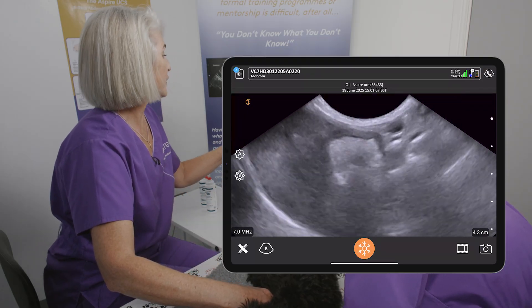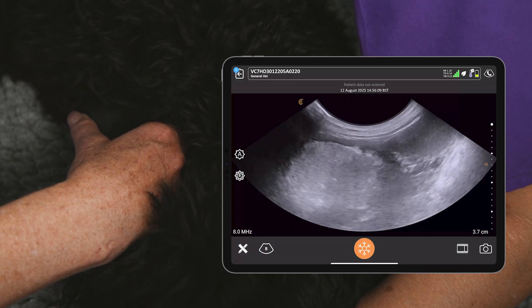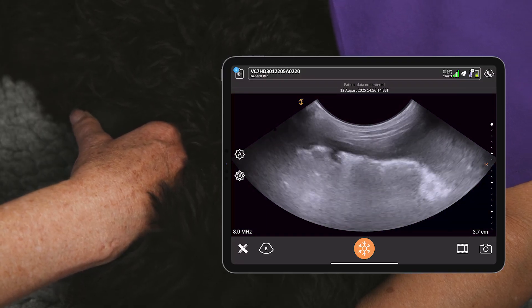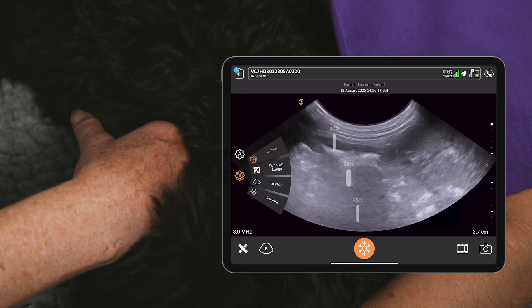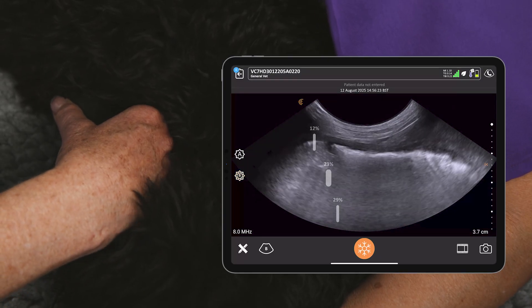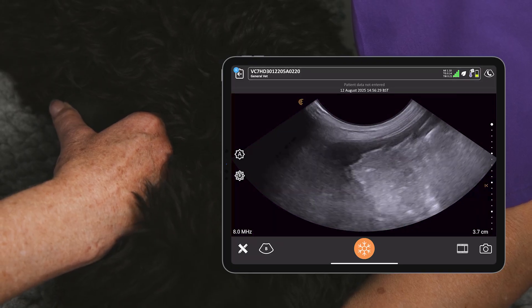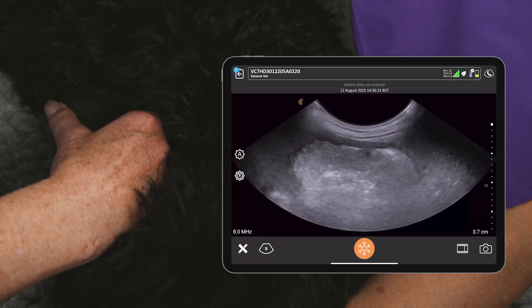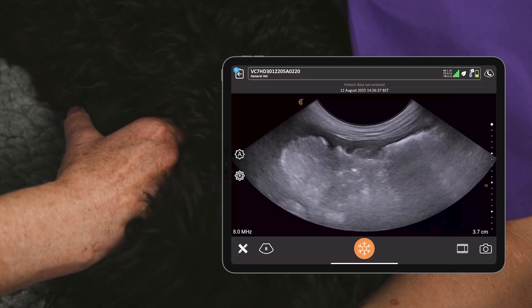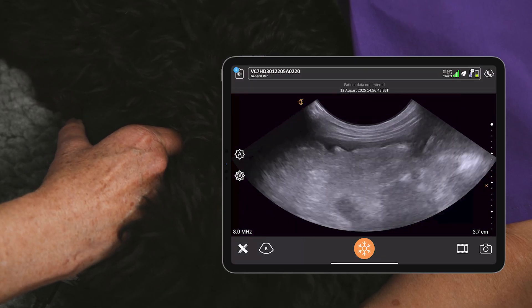Looking at the wall layers here, you can see it starts off hypoechoic, then hyperechoic, then hypoechoic again, and then you have this bright fine serosal margin around the outside — that's the normal pattern. If you have a loss of wall layering, that may indicate some sort of disease process. It's quite helpful to play with the dynamic range when looking at gastric wall layers, because we've got a black-white-black-white wall layer pattern. By going down on dynamic range you enhance contrast, so you should see that wall layer pattern a lot better than with a high dynamic range — a very useful tool.